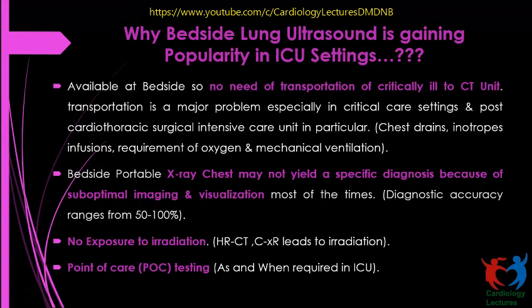Another thing: if you take the chest X-ray into consideration, it may not yield a specific diagnosis, because it is usually suboptimal imaging. You are using a portable X-ray machine, putting the cassette below the chest of a hemodynamically unstable patient, lifting them up, and then putting a beam from above where the equal distance for a proper view may not be there.